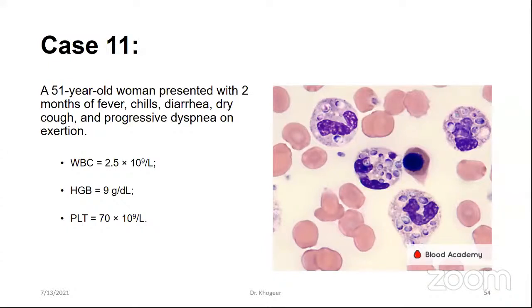You can find some abnormal or atypical morphology, but I don't think it exceeds 3% or maybe 5% of the neutrophils. This is why when we report dysplasia, we usually use the number of involved cells. Based on the WHO, any dysplasia above 10% is considered significant.